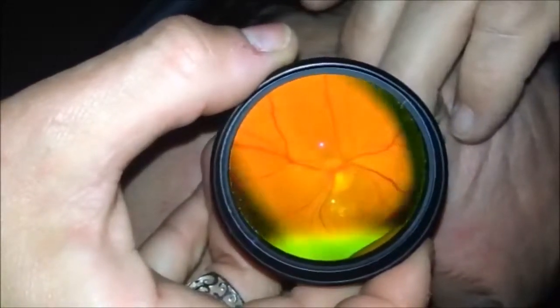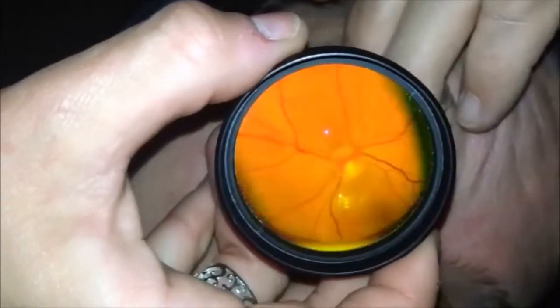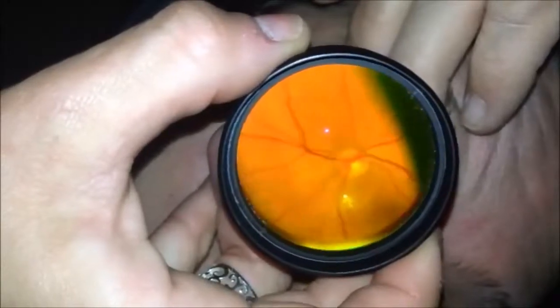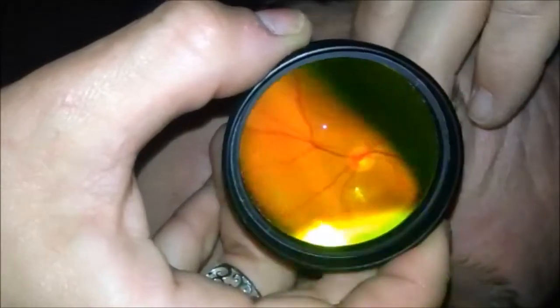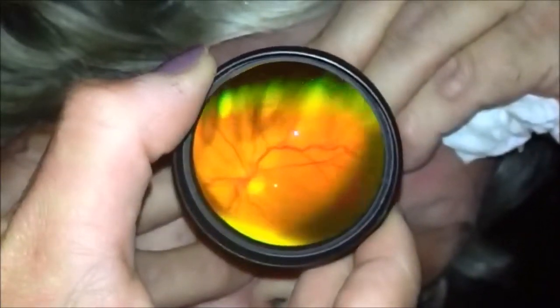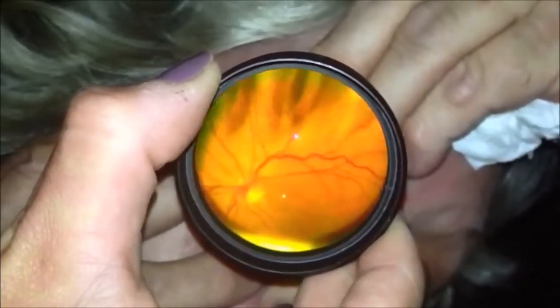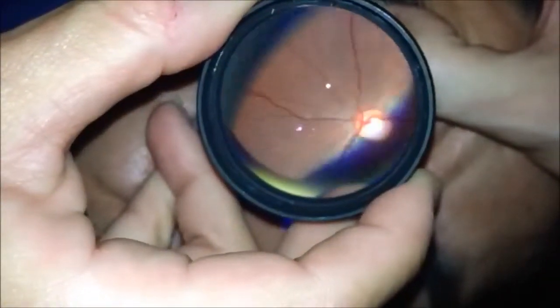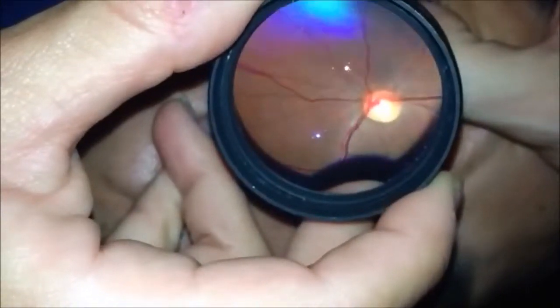The objective of this video is to demonstrate how retinal imaging, like what you will see here, can be taken by using a smartphone and a non-contact indirect lens. It can be a 20, a 25, a 28, or a 30 diopter lens. I will illustrate that you can easily investigate the optic nerve and the macular area in different clinical scenarios. You can also assess tortuosity of the vasculature and peripheral lesions.